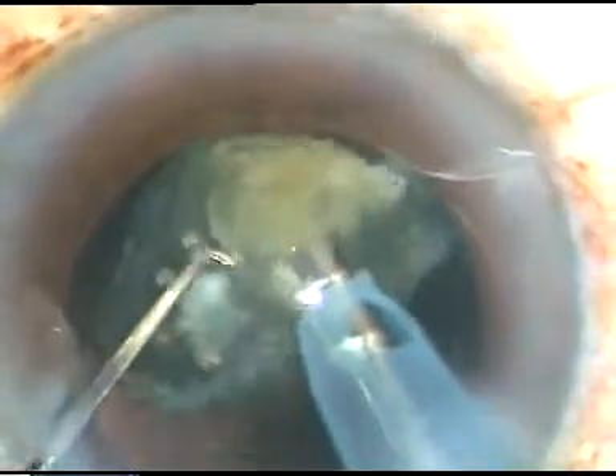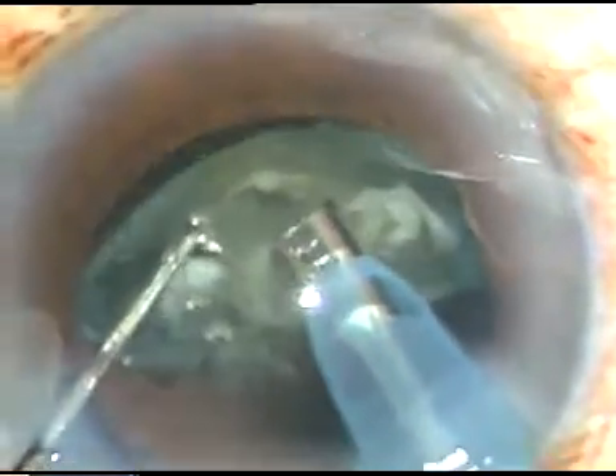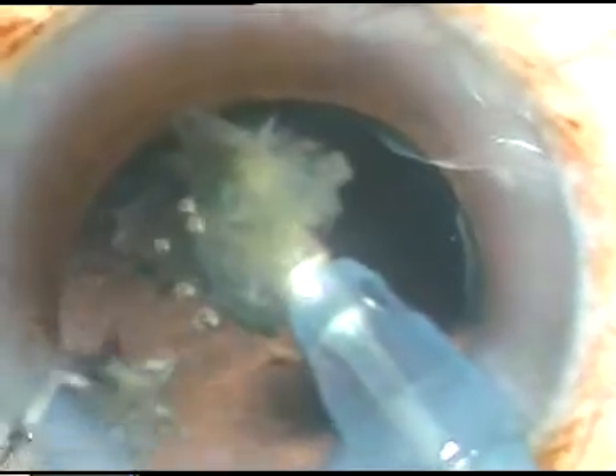This chopper has been devised by me — it's just a modified Sinski hook. The Sinski hook is thinner and it is a little stouter. This is the last fragment of the nucleus. In all three cases the phaco power was 80%. See the followability of these fragments. Although this is a peristaltic machine — this is Oertli's Cataracts 3 phaco machine — the followability of the fragments is so good. The fragments come to the tip just like a Venturi system.